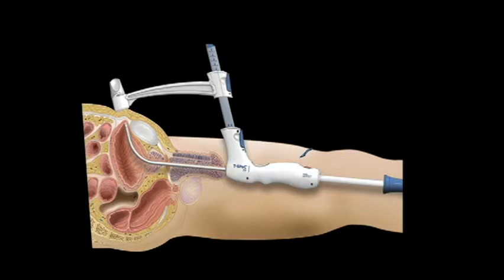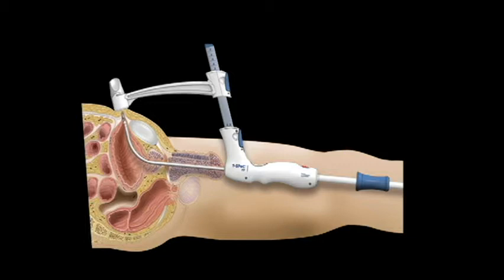The physician need only slide the rear handle this distance plus an additional 1–2 cm to fully engage the blade in the capture housing. Before the physician can advance the cutting blade, the handle and blade mechanism is released by removing the safety cap and rolling the lock wheel to its forward position. Keep hands clear of the surgical field during blade advancement. The cutting blade is advanced by sliding the rear handle forward. The smooth action of the cutting blade mechanism ensures a precise and relaxed cut from the bladder wall to the abdomen surface. The rear handle is advanced until the cutting blade is embedded in the capture housing, which is precisely positioned over the patient's abdomen to receive the cutting blade.